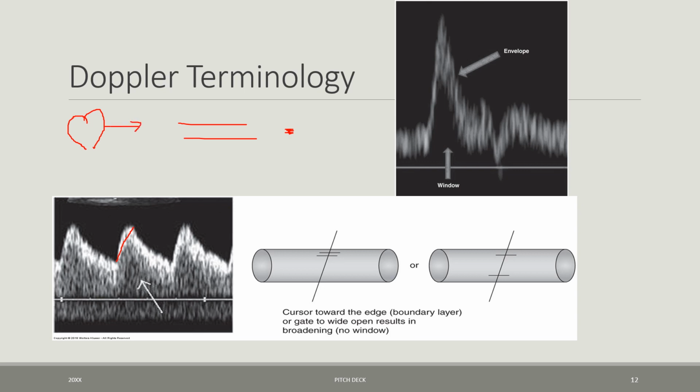So when I say that we have a systolic upstroke on one of my spectral Dopplers, you're going to be looking for this systolic upstroke. It says this red blood cell is moving forward, forward, forward, forward, forward, and then it gets to a peak. Now, you're going to see it start to drop. Now, you might think of this as it's slowing down or as it reversing, but it's not reversing. This heart stopped squeezing and now it's still flowing forward, but it's flowing forward at a slower speed, and that's why you see it taper off here.